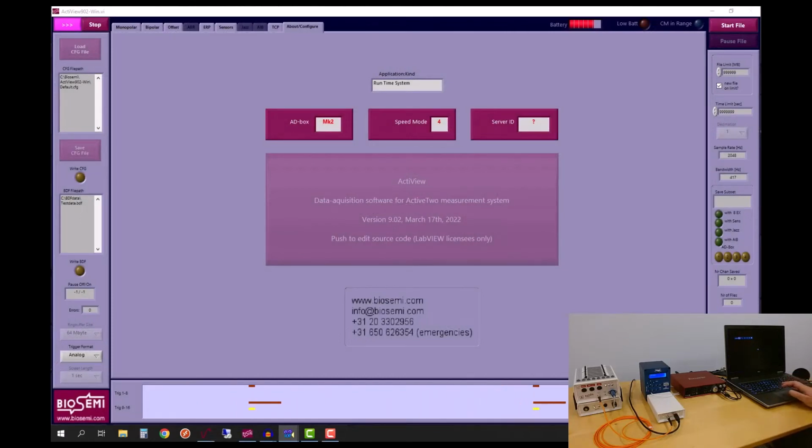So the two codes that are aligned, the one that's at the top of that trig 1 through 8 field, and the code that is well below it, in yellow, those two relate to the USB serial port. So the code comes in here on the back of Triggy, on the Biosemi trigger cable, and it is detected by Triggy, and Triggy also generates an output bit. So the top code that you're seeing, the short top code, is actually the serial port trigger event, and the yellow one is basically a reflection of that.